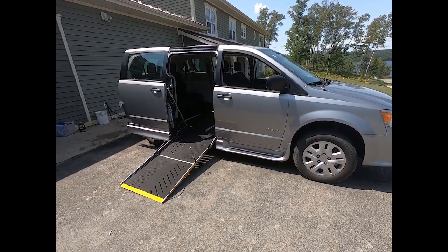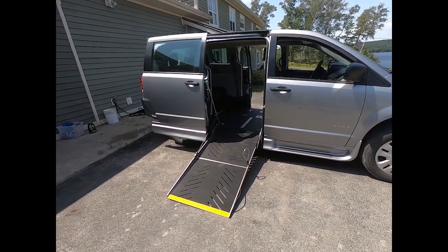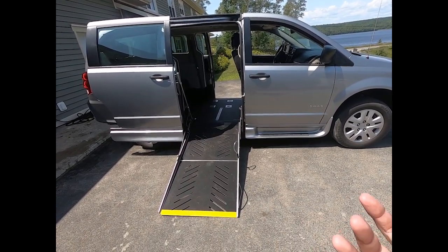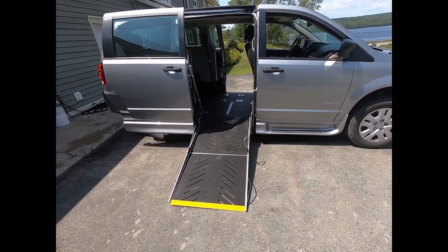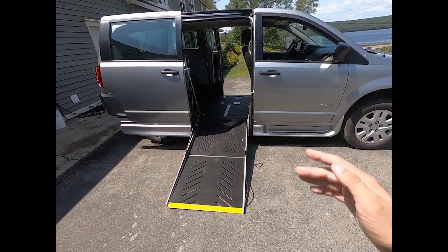This client has a very capable upper body, but he is in a wheelchair. If you know much about wheelchair accessible vans, there are essentially two types: manual vans and power vans. With a power van, you hit a button on your key fob, the door slides open, your ramp deploys, and you can go up and down the ramp in and out of the vehicle.